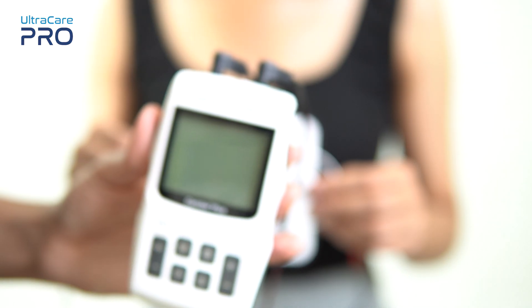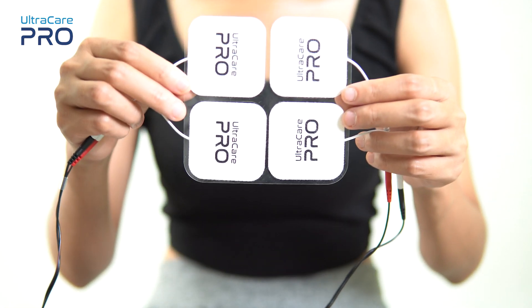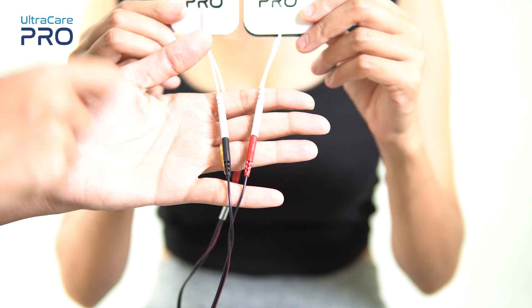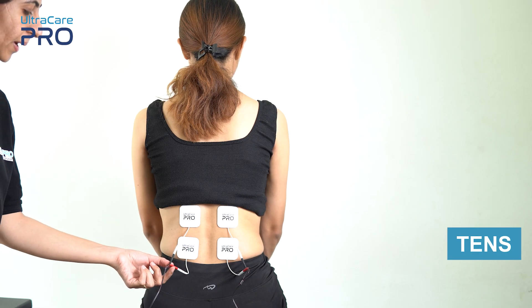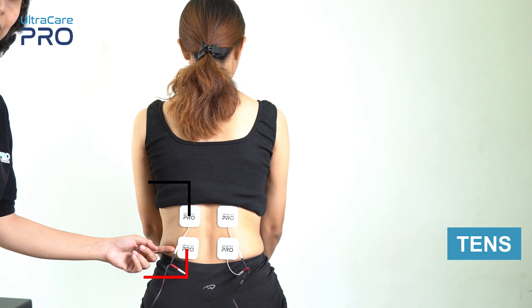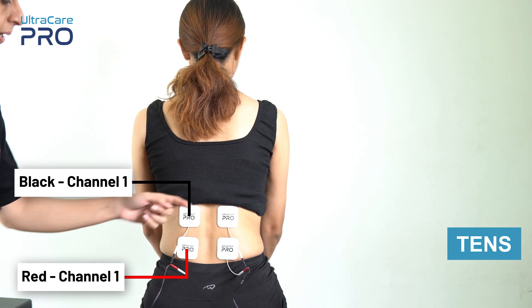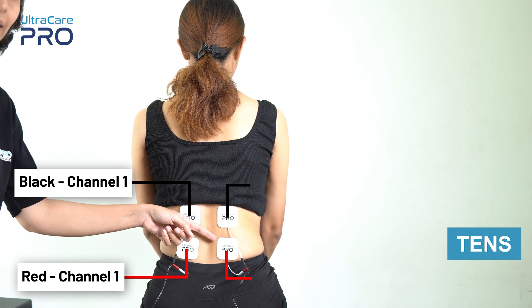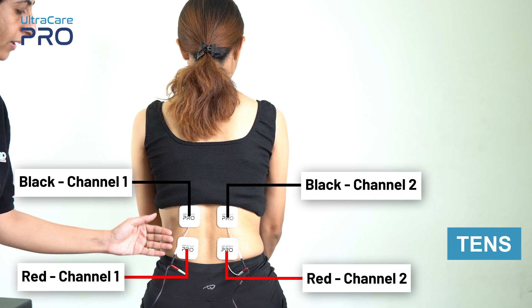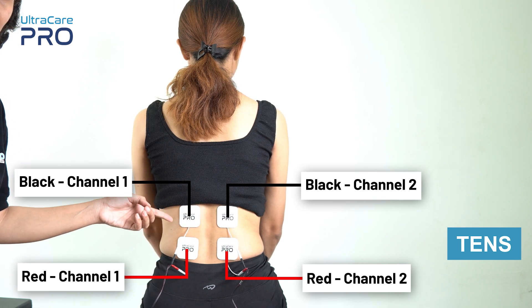Each channel supplies current to two electrodes — one red and one black. For dense application, place the black and red electrodes one below the other from channel 1 on one side of the back. Similarly, place the red and black electrodes from channel 2 on the other side of the back, so the wires cover the entire area of the back.